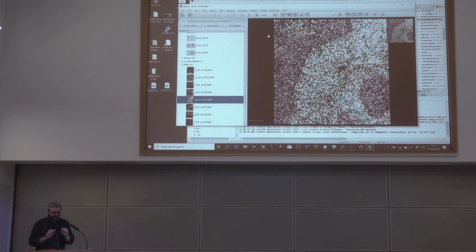That's also one of the goals of trying to get the deep learning support within QuPath, and to have the ability to have cell segmentation algorithms that work for that kind of data. Because I think that can be a big source of error. I think it's a difficult research problem to solve, even for one image set, but to generalize across different types of staining, it becomes incredibly hard.